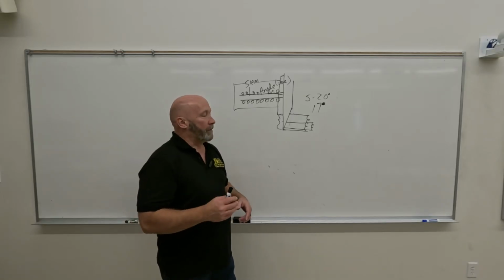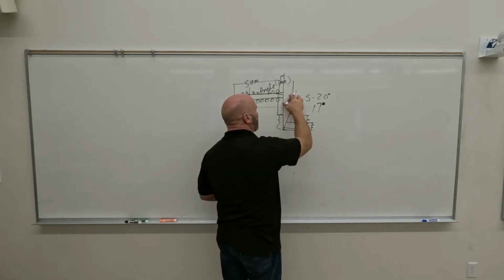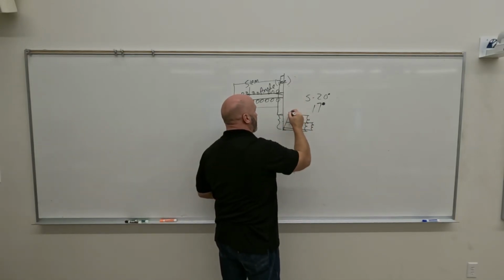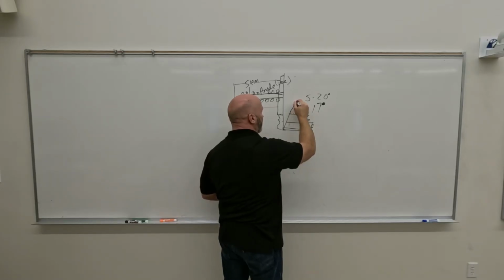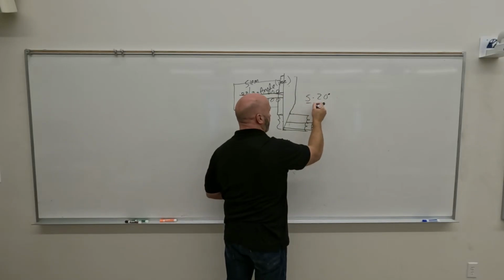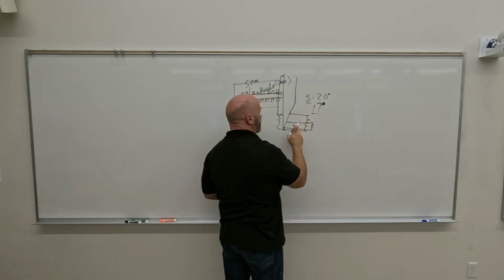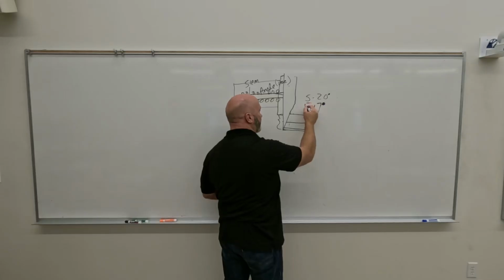Some tubes are what we refer to as bifocus tubes. And with bifocal tube, we touched on that on Friday. With bifocal tube, what we may have is we've got an anode angle here, and then it may go into a steeper angle. So it may be both 5 and 17 degrees. Large focal spot will be on the 17 degrees, small focal spot will be up here.